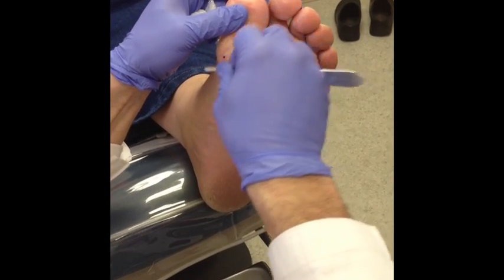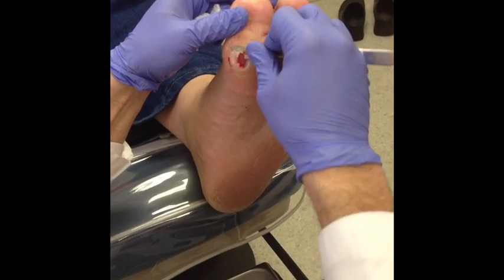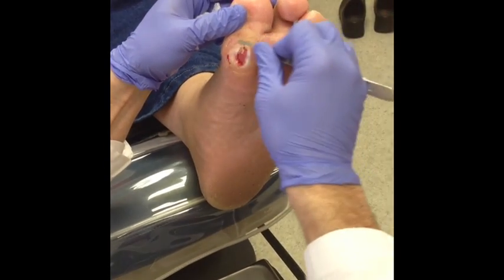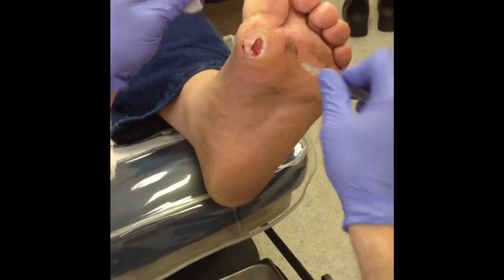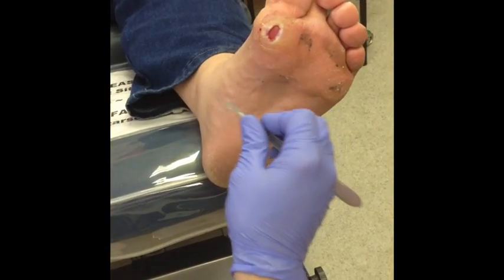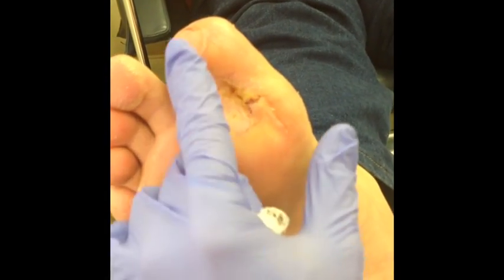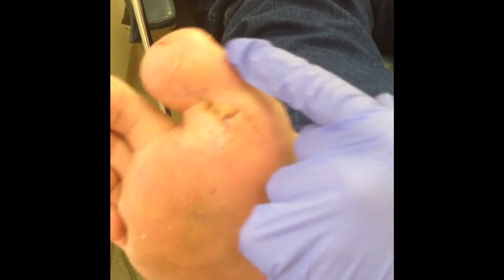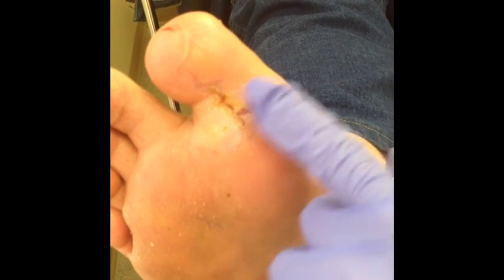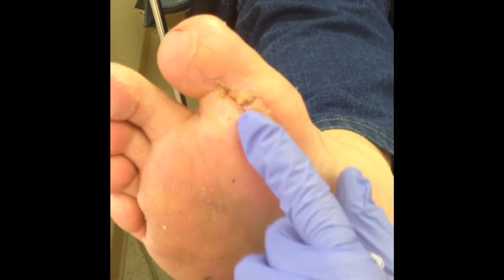The next key after we remove this down is we have to find the best way of offloading this foot. Now just as an example, this is how it was — he already had one surgery. And if you look at this other foot right here, this foot recently healed from a wound that was open for a long time. He's had a couple of surgeries here; we had to take out a big portion of the bone to get this healed. But finally it's healed, so now we're going to work on this one to get it healed.